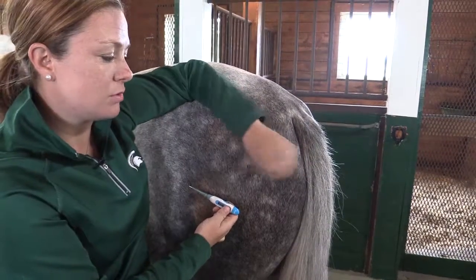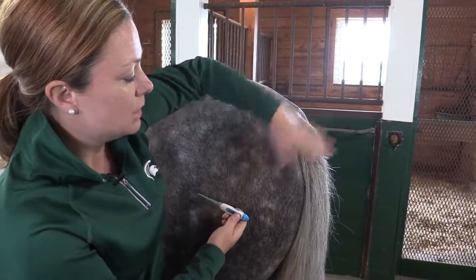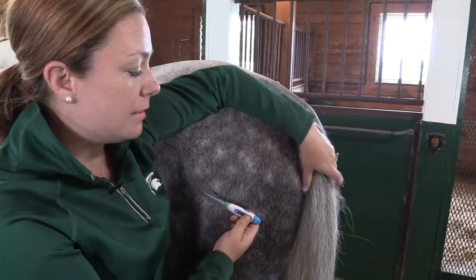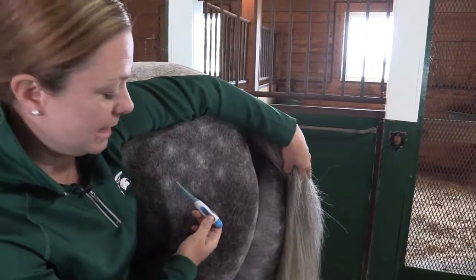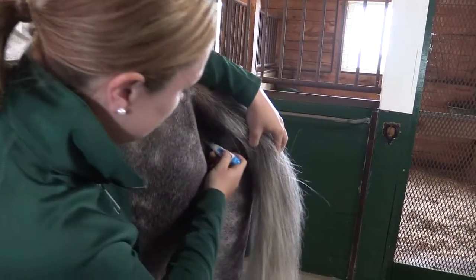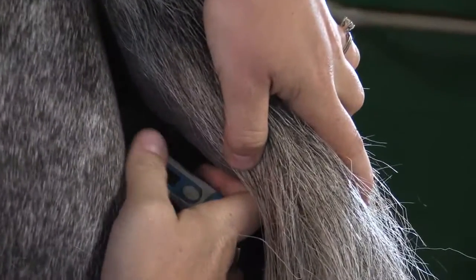I've seen lots of people do this when they're standing directly behind the horse — that's just not ideal for safety. We have the horse's tail, and if they really don't want you to take their temperature, this is a pretty strong muscle so they can clamp it down. What I like to do is just push the tail off to the side, turn my thermometer on. I'm going to insert it about an inch and a half to two inches into the rectum, and then I'll just wait to hear the beep.